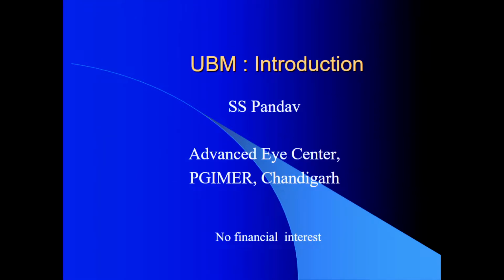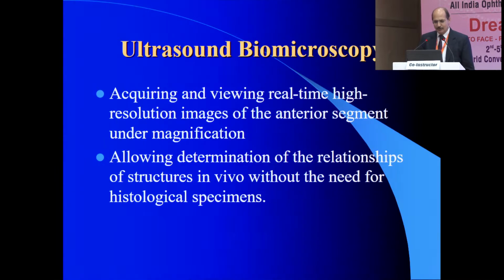I think Dr. Smita has already introduced the topic. So what I'll do is I'll just introduce the technology, because we are talking a lot about UBM in this. I'll give you a little bit of recapitulation about the technology, what the UBM basically is.